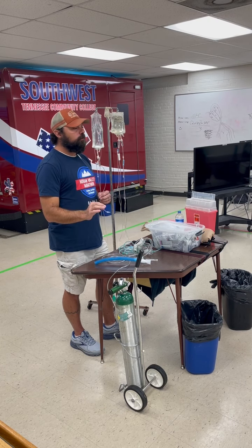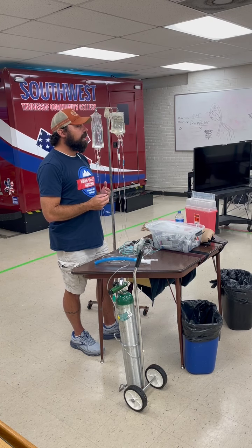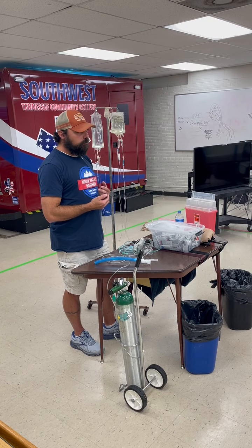Rapid assessment. Listen to breath sounds. And if they're having a really, really hard time talking, Adeline, should you ask them 9,000 questions right then? No. I'm going to give you a quick story. These are free. Josu, these are free. I'm not charging you for these, but I will throw them in so you remember stuff.